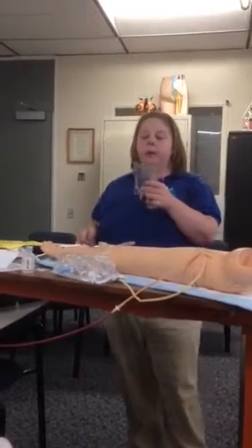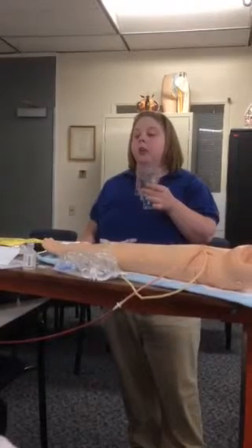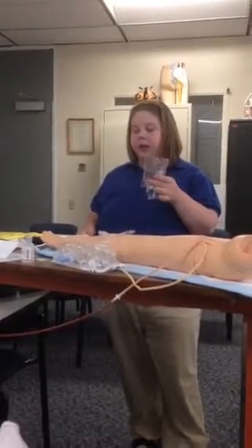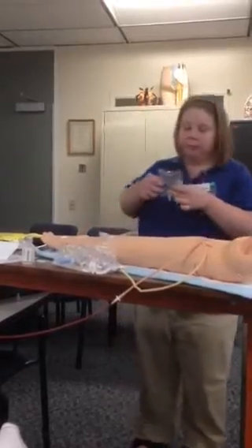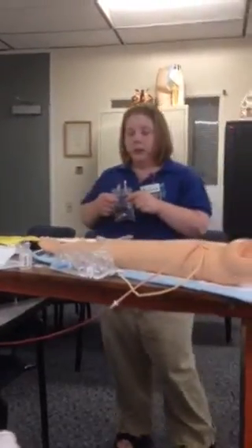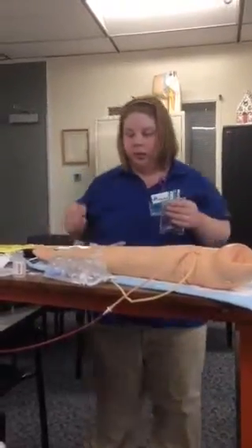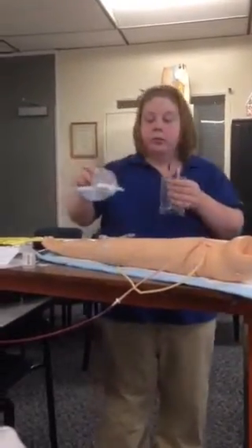and I will label my bag with my initials, the drug, the dose, the rate, the date, time it was given, the route it was given, and I will now attach my tubing.